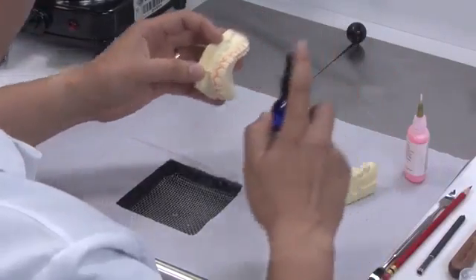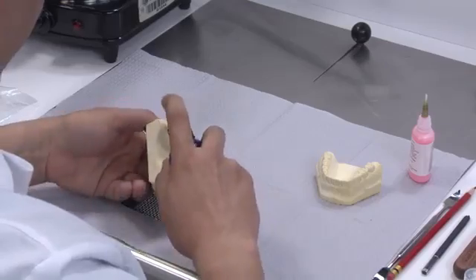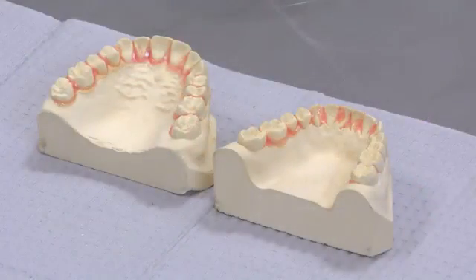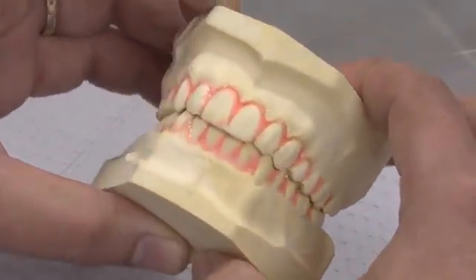Next, spray an accelerator to cure the blockout material more quickly. Allow the models to dry on the bench for 30 minutes, or dry models under ventilation for 10 minutes. Make sure the blockout is complete.